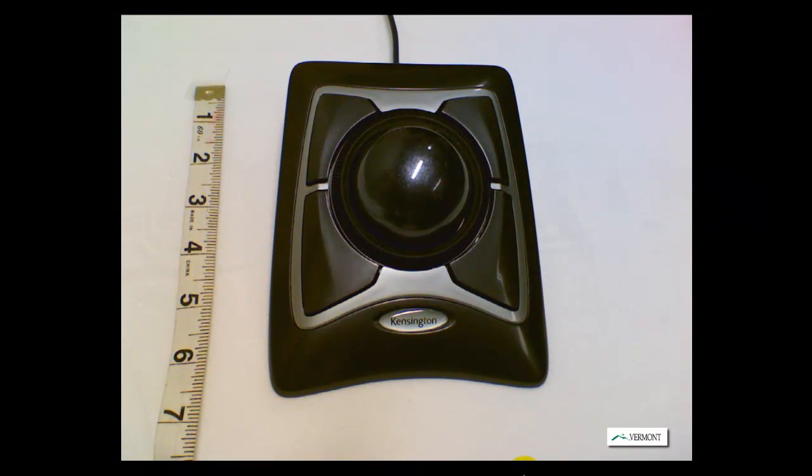This is a commercially available trackball that can be used as a mouse alternative for accessing a computer. For this demonstration, we are going to be using a trackball by Kensington. It is known as the Expert Mouse.